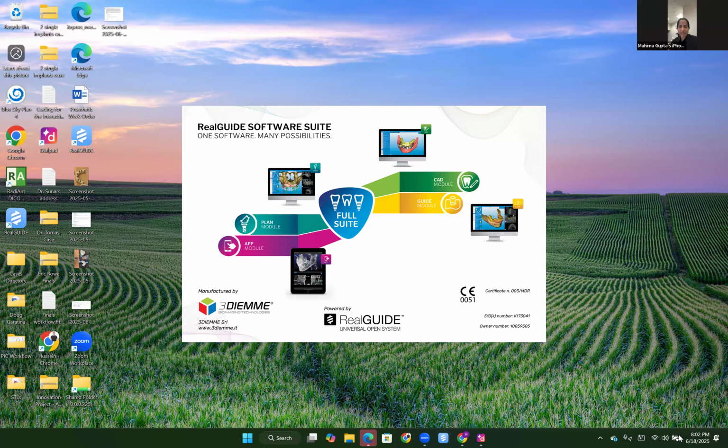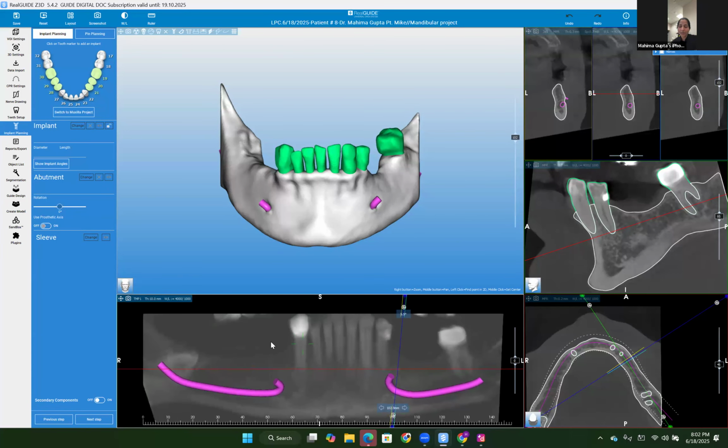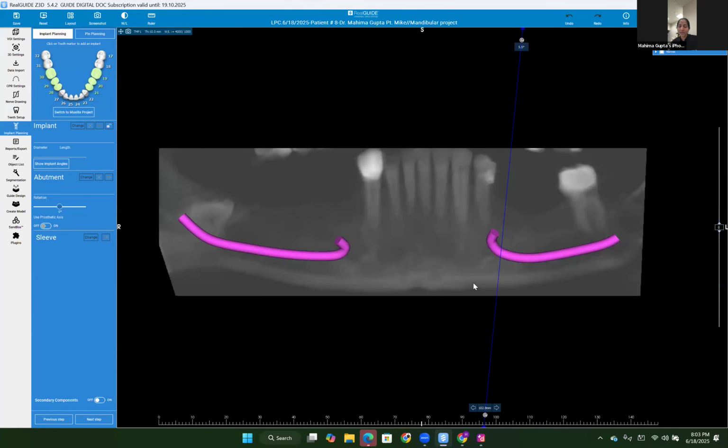My biggest concern in the case was the positioning of the implant at 19 and 30. My confusion was because Dr. Resnik teaches that you are supposed to put the implant in between the foramens, but it looks like I do have space at 19 and 30. So my biggest question is, should I place the implant at 19 and 30 or should I still stay in between the foramen? So you're taking out all of the teeth here, correct? That's correct. And you're able to get implants interforaminally. You're asking, should you put one at 19 and number 30, correct? Yes, that's my biggest question.